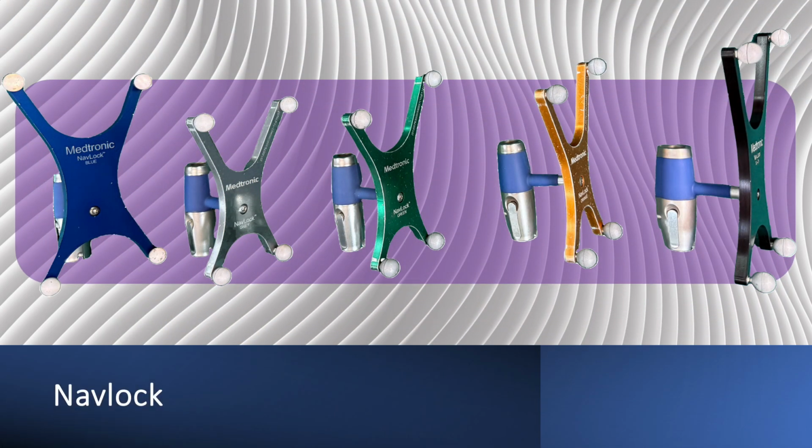Navlocks are used to identify pre-registered instruments in navigation. Large navlocks, blue and black, are used with long instruments, while small navlocks, orange, green, gray, and purple, are used with short instruments. Trackers, which have posts for attaching reflective marker spheres, are detected by the navigation camera to track the position and orientation of instruments accurately. They are easily attachable to Navlock-compatible instruments.